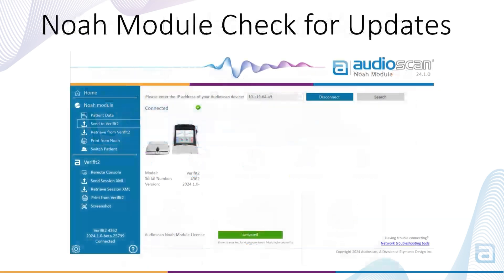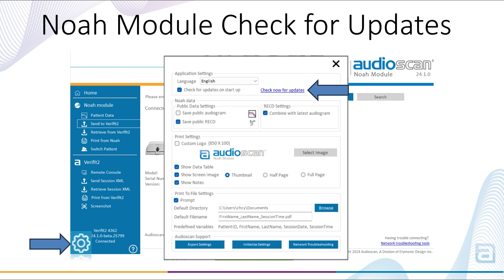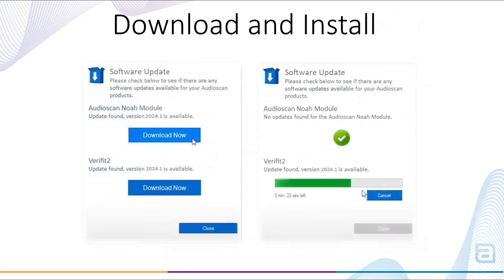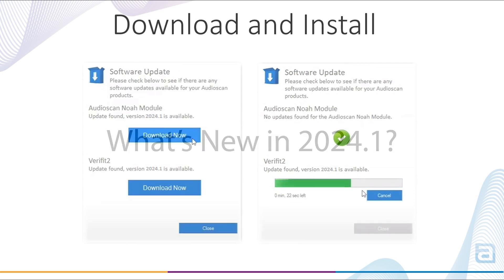Software updates are also available via the AudioScan NOAA module by selecting Settings and clicking Check Now for updates. Note that a checkmark beside Check for updates on startup means that you will be notified when new software versions for your AudioScan equipment and NOAA module are available. If an update is found, you will be prompted to select Download and then install the software.